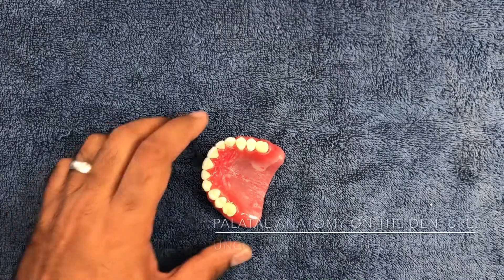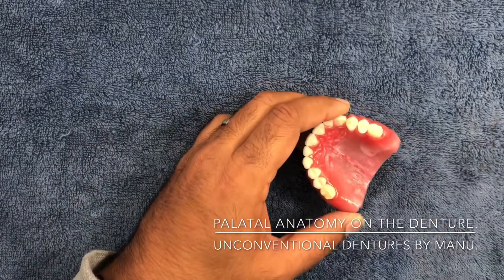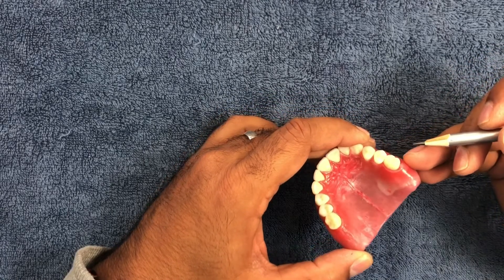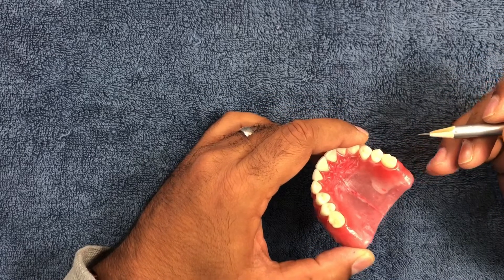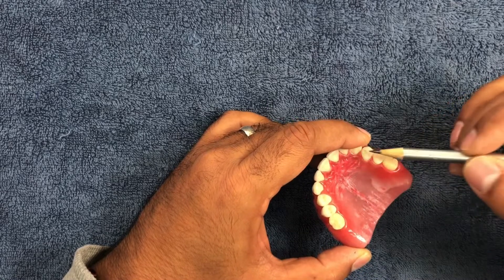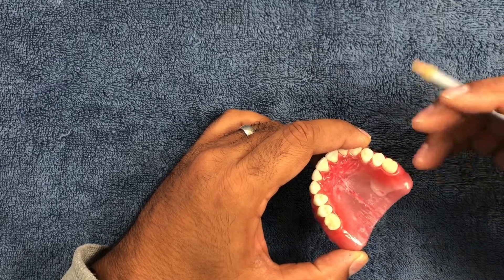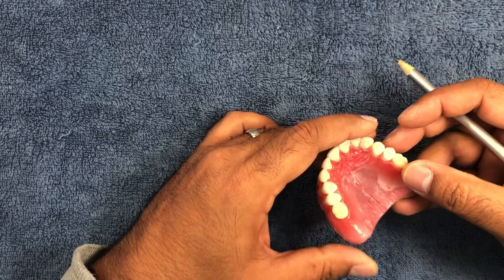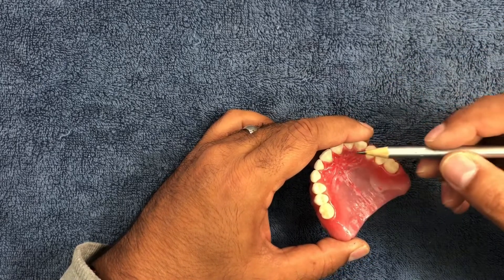Hello guys, this is Manu. I'm back again with this video regarding queries I've received about the palatal anatomy I carve on dentures — why I do it and how I do it.